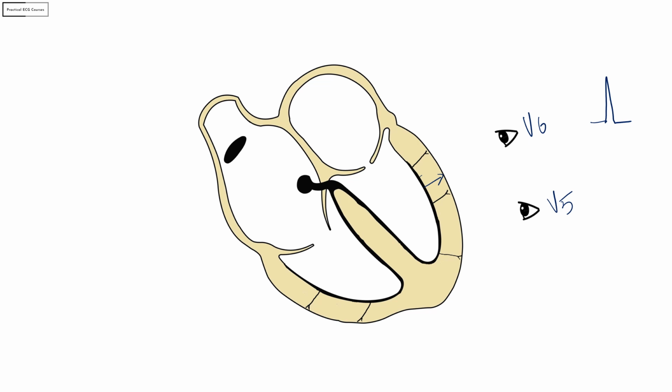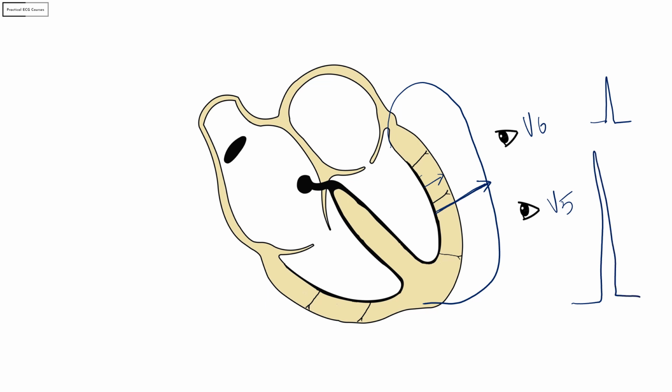Now suppose you have a thickening of the left ventricle, as in a left ventricular hypertrophy. What happens to the vectors now? It becomes significantly increased in amplitude because the vectors have to now travel through the increased thickness from the endocardium into the epicardium. And how is this deflection inscribed on the ECG? Because there is an increased thickness of the ventricular muscle wall, myocardial wall, there is more depolarization, more current, and therefore more voltage. On the ECG, this is documented as a tall amplitude of the R waves.